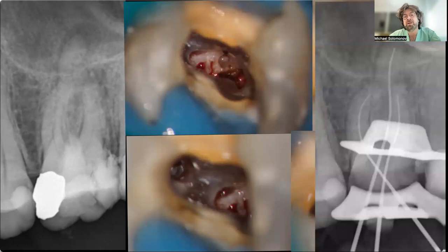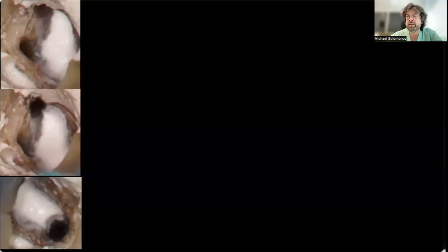In the end, I did an X-ray for working length determination to check the apex locator data, and I prepared the canal to number 30. I put calcium hydroxide not just inside the canal, but first of all on the area of this perforation, not in a creamy mix but much thicker, like for apexification. And you see a really thick paste of calcium hydroxide.